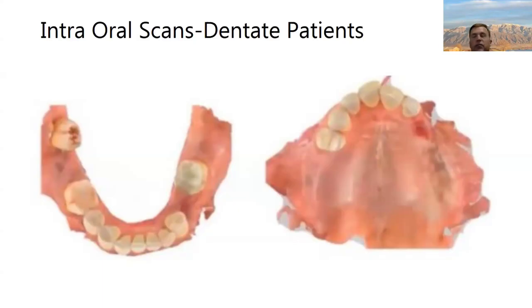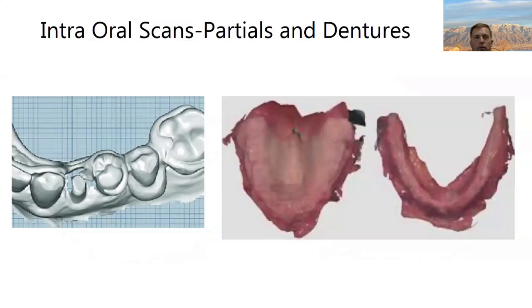The other thing to keep in mind is sometimes you may want a backup denture, or you may be doing a clear denture workflow for freehand surgery. So if you discipline yourself to always take a denture size scan, then you don't have to change your workflow.